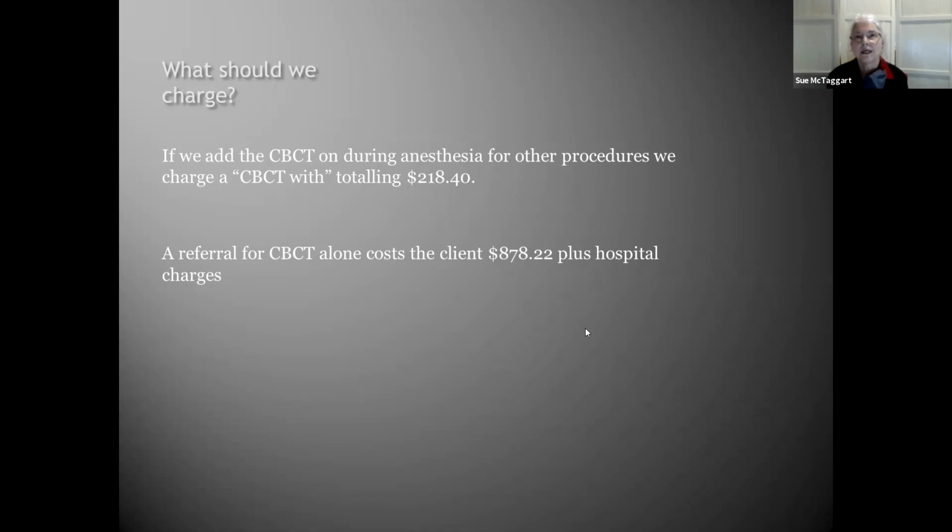And then when they come back for a recheck, and each year when they come in, I think they should have a screening done, which would then also be a repeat scan a year later, because you never know what changes have occurred in the TMJs, the ears, and nasal. I didn't even cover a nasal case. We are seeing a lot of changes from one side to the other in the nose, and it helps us.